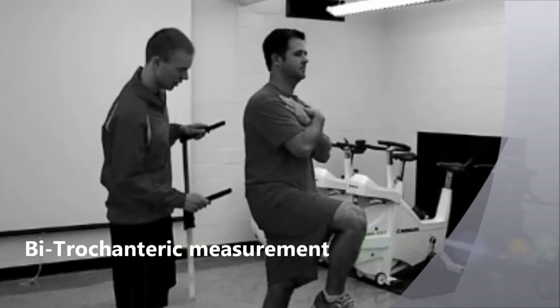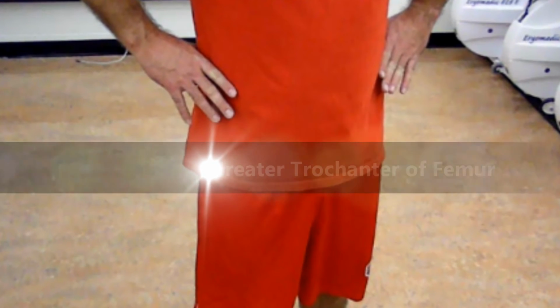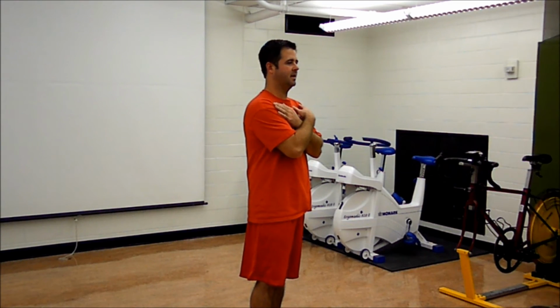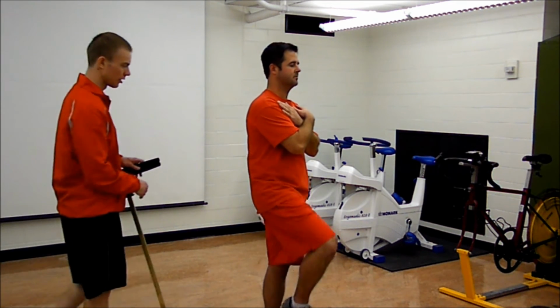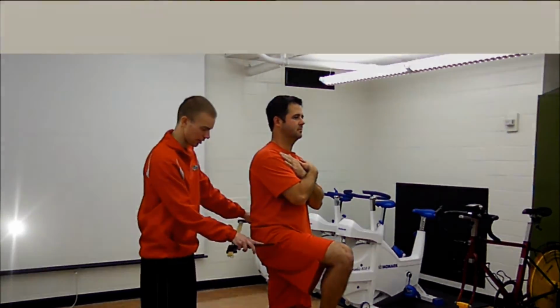The anatomical reference point for the bitrochanteric skeletal diameter measurements are the greater trochanters of the femur. The client should be standing upright with the arms folded across the chest. This allows the technician to have an unobstructed view of the anthropometric caliper.